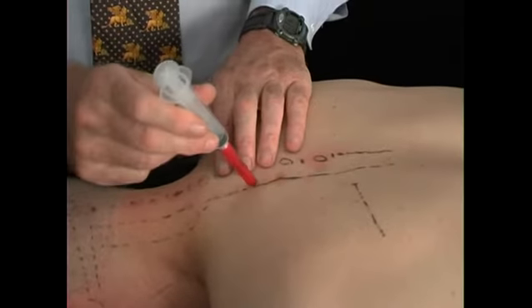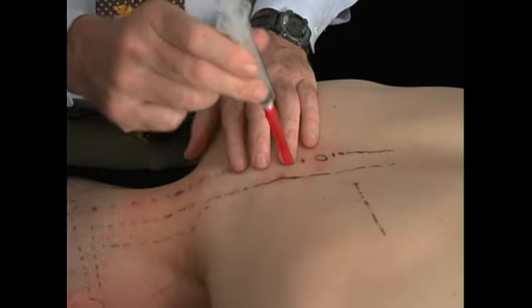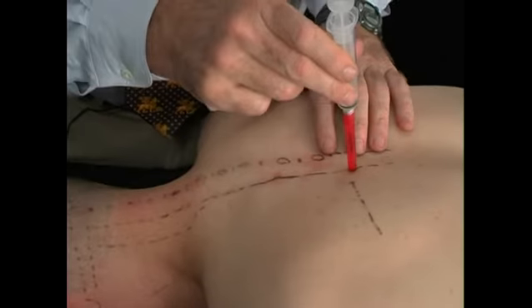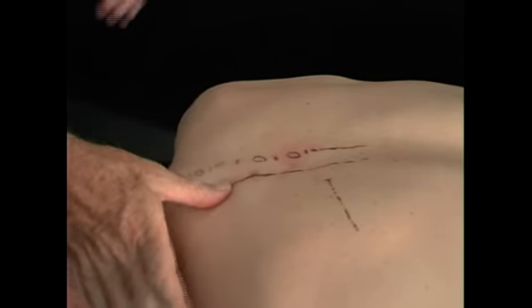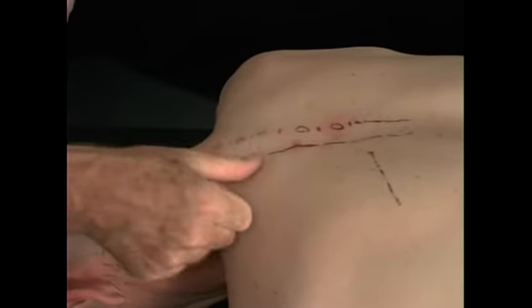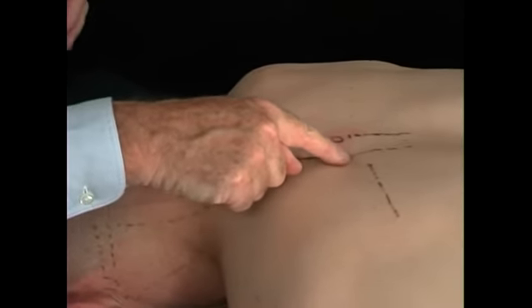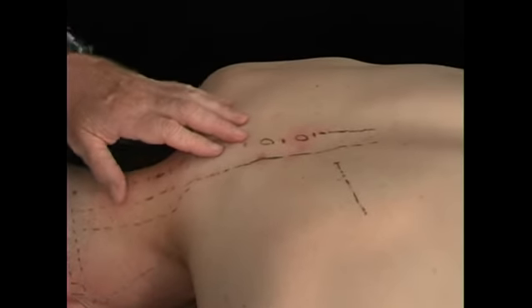When we're first starting these injections, I recommend doing individual injections, just pulling the needle clear out, and moving right on down, meticulously injecting this area. And of course, we've already palpated with our thumb or forefinger and moved right on down, individually finding the tender areas and focusing on those tender areas of injection.